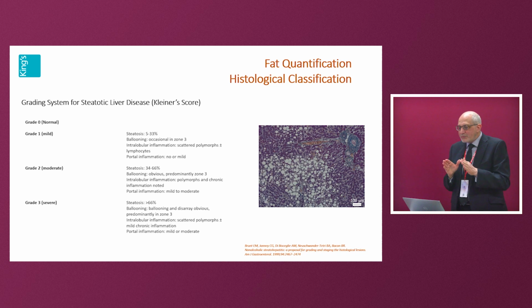So this will probably disappear, just like liver biopsy for fibrosis is going to disappear, because you're compartmentalizing the degree of steatosis or fibrosis, based on an individual subjective thing, into a compartment. It's a continuous issue. So if you have a figure that gives you that measure on a continuous scale, you are doing better.